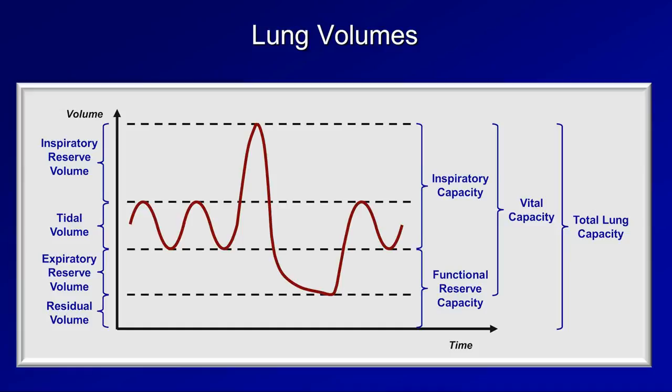I appreciate that these 8 terms seem more numerous than necessary and seem easy to get confused. That will become even more true once we start referring to all of them by their acronyms. All I can say is that I'm not personally responsible for the terminology, and you will really need to be able to use most of these terms fluently to have a solid understanding of PFT interpretation.